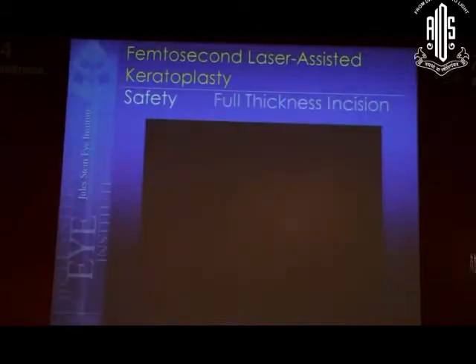When you step on the laser, you should not see these bubbles. When you see those bubbles, what that means, of course, is the energy is going into the anterior chamber. You should stop immediately. Reset the depth for 70 or 100 microns less posterior. But in this case, I didn't do that. So we had a full thickness trepanation.